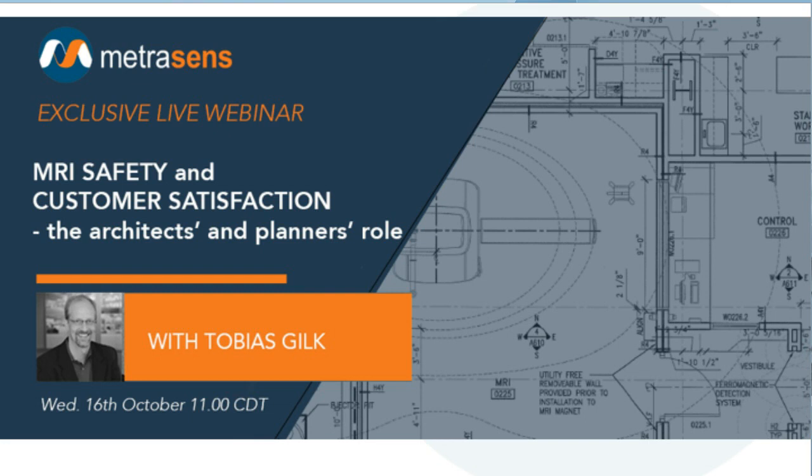for MRI rooms. I would recommend those in addition to looking at design recommendations in the equipment siting manuals. So from your GEs, your Philipses, your Siemenses, they will frequently have, in the siting manual, not necessarily on the drawings, a set of recommendations. And between those two, I think you can pull up some really useful information.